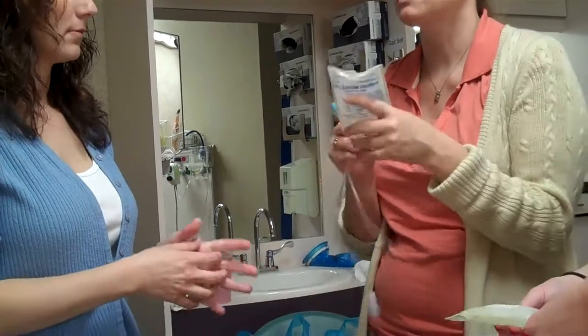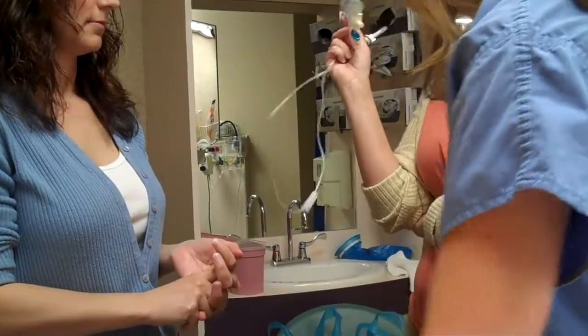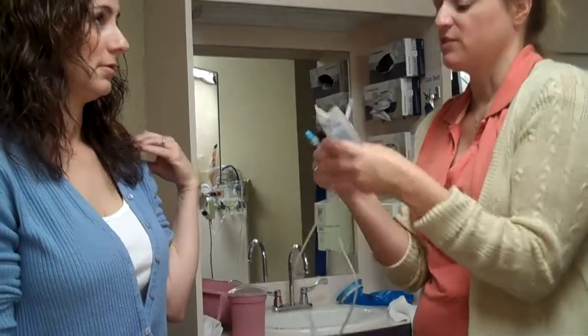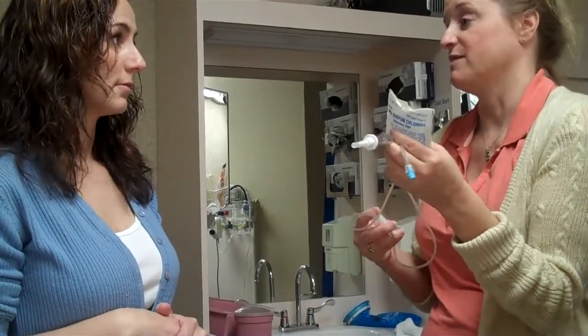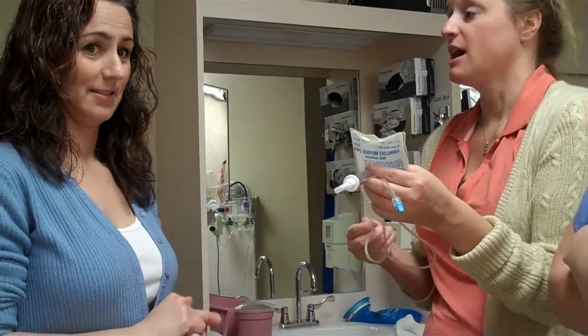With this one, you can turn your back. You don't have to watch. This one, you're going to watch and infuse. You're not going to leave. Remember, this is toxic if we go too fast. And if you're going too fast, you're just going to slow it down. I'd like at least a half hour. I prefer 45 minutes. The slower it goes in, the better.